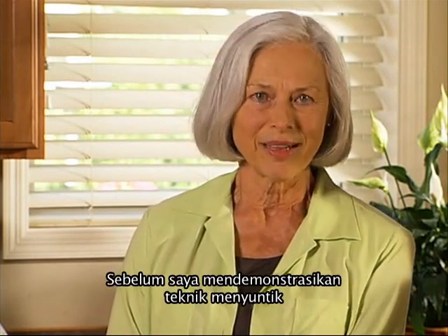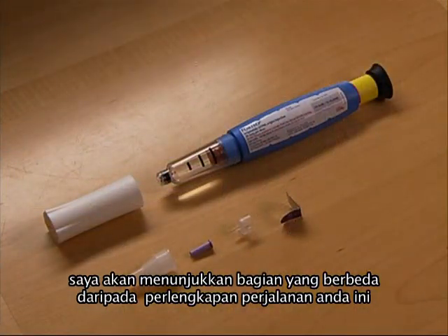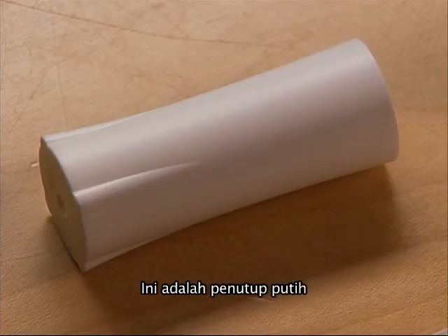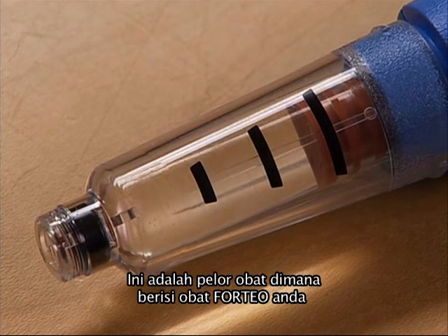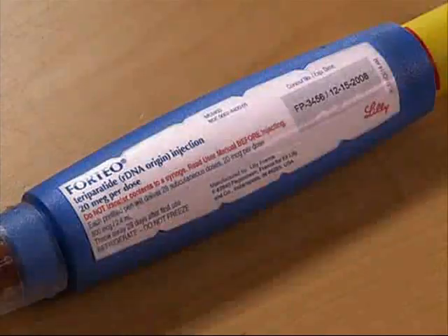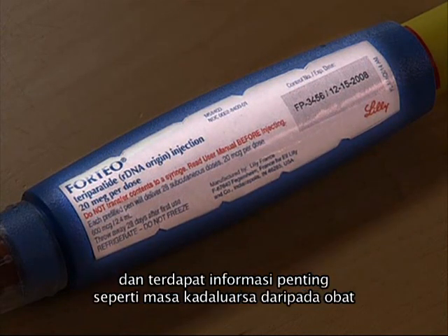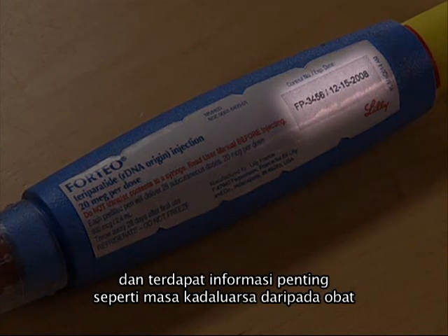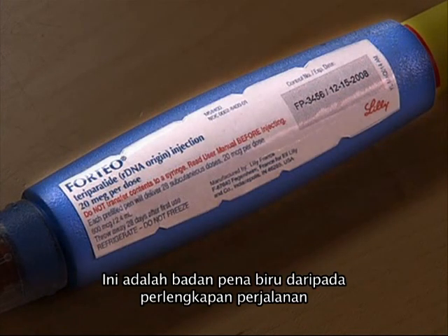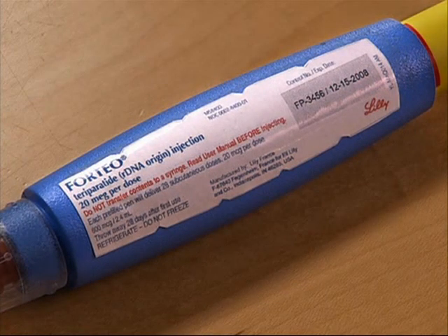Before I demonstrate the injection technique, I will point out the different parts of your delivery device. This is the white cap. This is the medicine cartridge that contains your Forteo medicine. This is the label that identifies the Forteo delivery device and contains important information such as the expiration date of the medicine. This is the blue body of the delivery device. It has been designed to be easy to hold while you perform your injection.